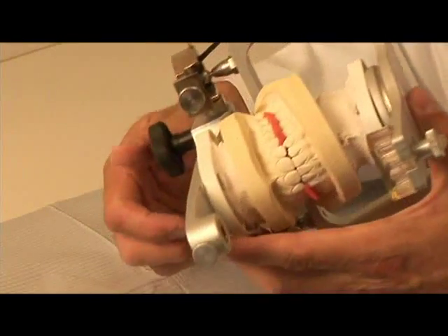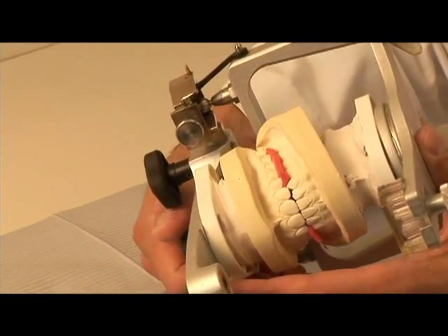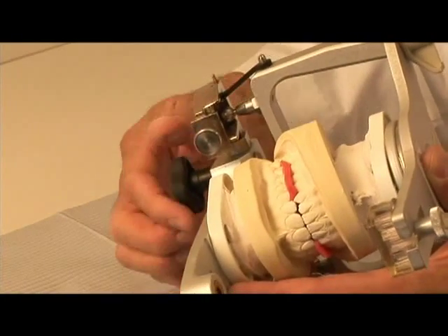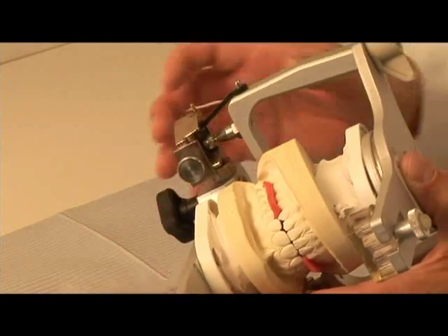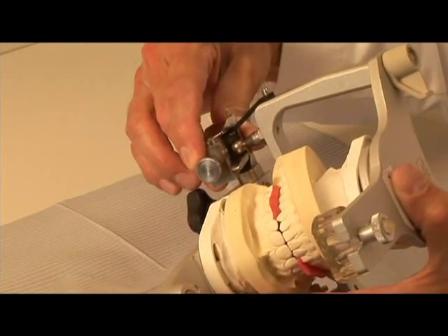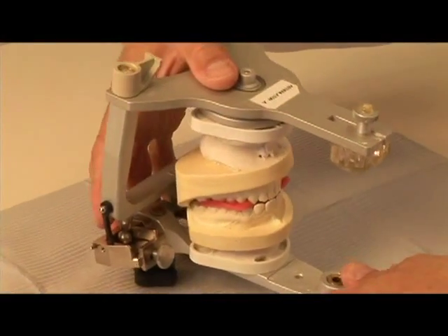Loosen both condylar guide elements by loosening the black clamp screw knobs. When loosening the clamp knobs, ensure that you keep them snug so that rotation of the condylar element is accomplished without losing the ability to control the rotation. Place the articulator upside down.